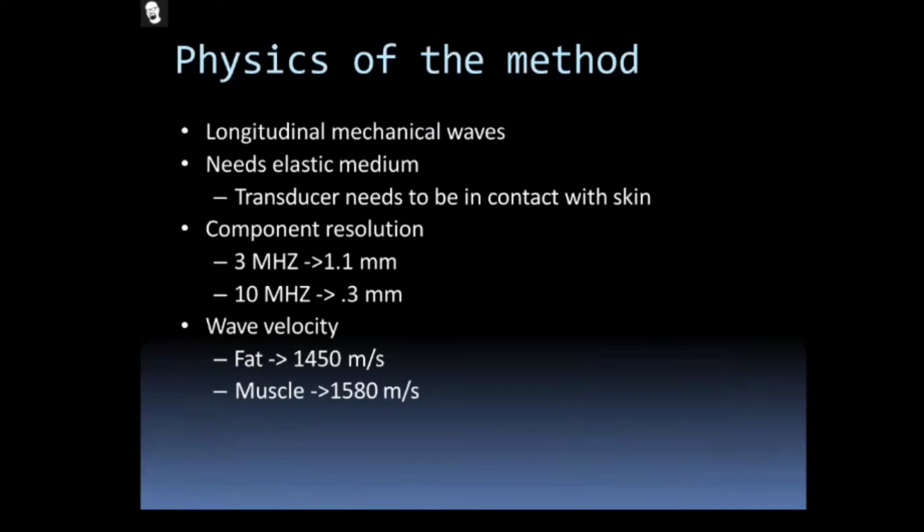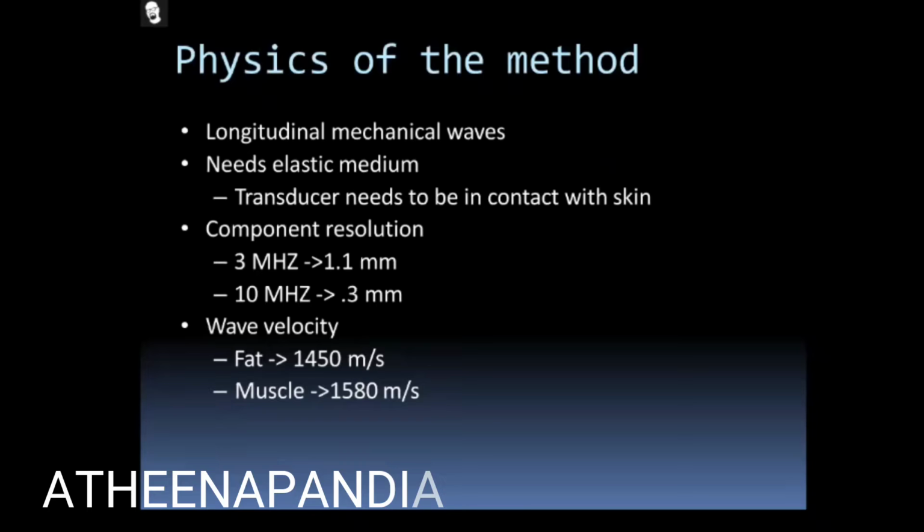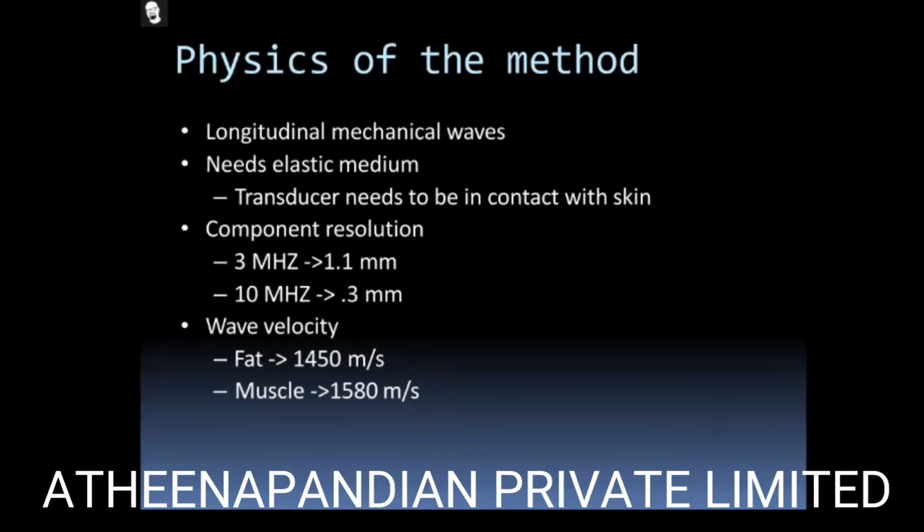What we are going to discuss is a small recap, because in the previous sessions we covered the radiological equipment, that is CT, MRI, and X-ray, the concepts, the components, and the other benefits of this radiological imaging. In the seventh session, we initially start with how this imaging differs from the other three imaging techniques we covered.